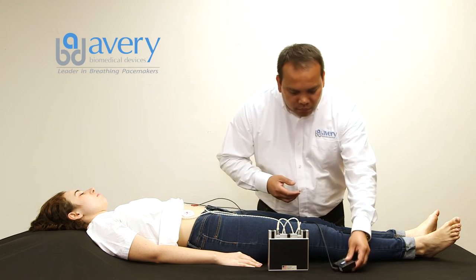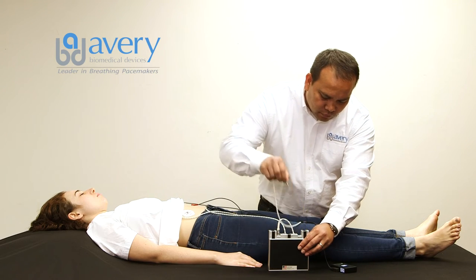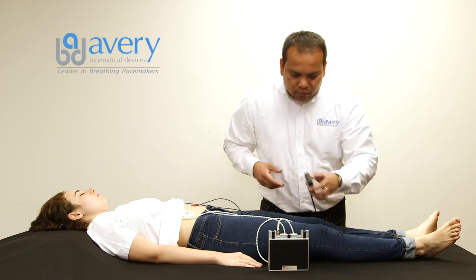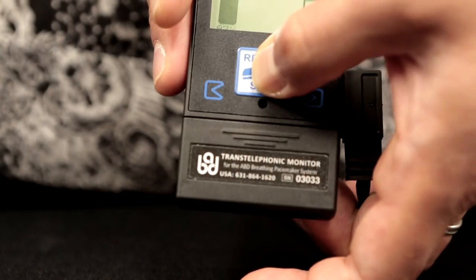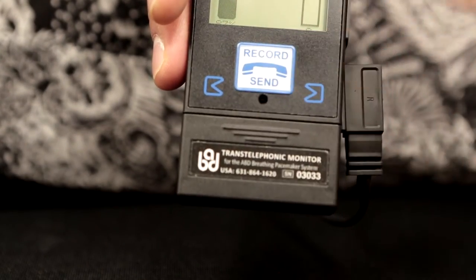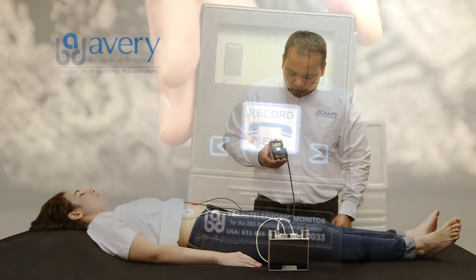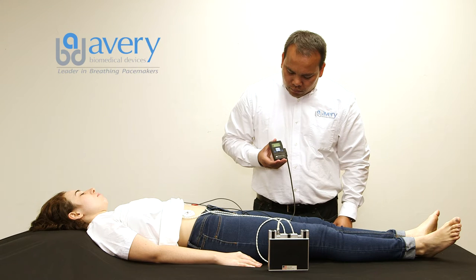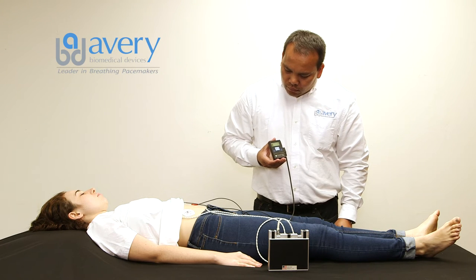Disconnect the right side antenna from the transmitter while keeping both sides of the transmitter turned on. Press one of the record/send buttons for two seconds until a continuous audible tone is heard, and then release it. The display will show recording during the entire recording process. At this time, electrical signals from the diaphragm activity are being recorded into the TTM.